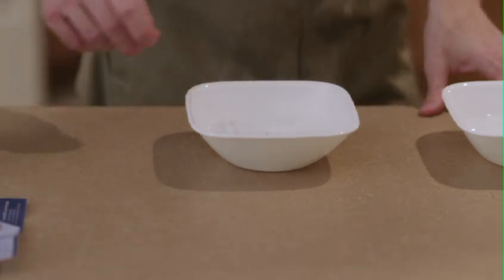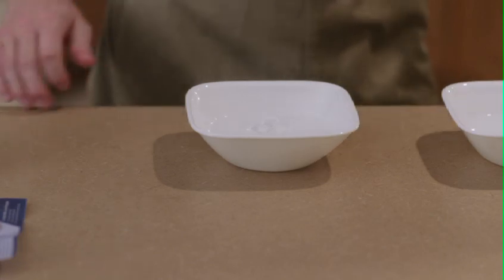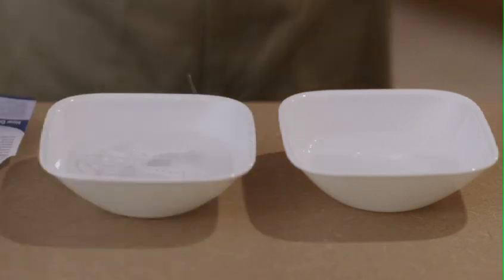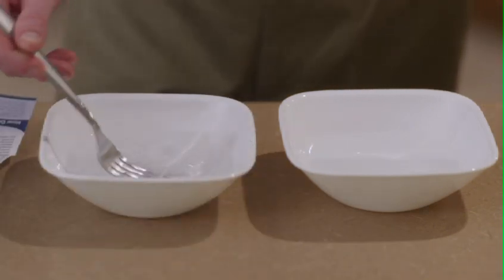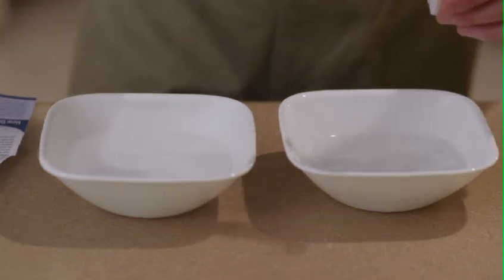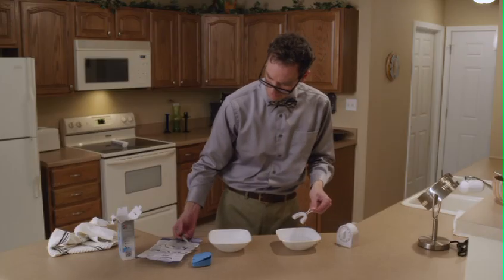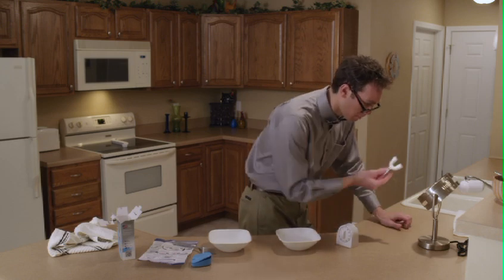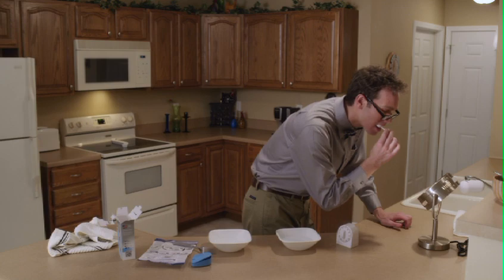Place the Dental Guard loaded in the forming tray face down in the hot water for 60 seconds. Remove the Dental Guard and custom comfort forming tray with a metal fork, using the openings in the tray handle for leverage. Quickly submerge it in room temperature water for no more than one second. Immediately pick up the Dental Guard by the custom comfort forming tray handle and carefully place it in your mouth so that the guard will form to your upper teeth. Do not bite down yet.